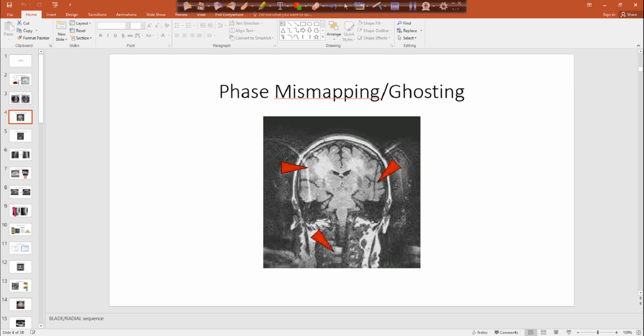Here's that motion artifact, patients wiggling in the coil. Our phase direction is right to left. This is a coronal image. So our right to left is the shortest axis. So this is the phase direction that it's streaking across.